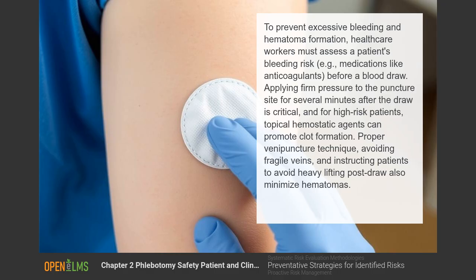Healthcare workers must assess a patient's bleeding risk, e.g., medications like anticoagulants, before a blood draw. Applying firm pressure to the puncture site for several minutes after the draw is critical, and for high-risk patients, topical hemostatic agents can promote clot formation. Proper venipuncture technique, avoiding fragile veins.